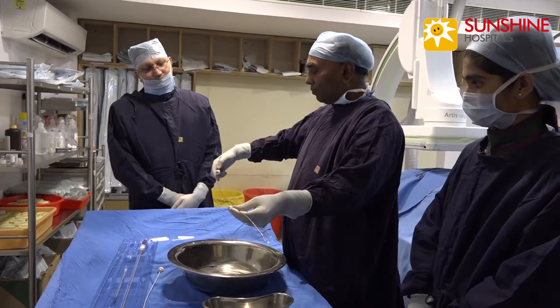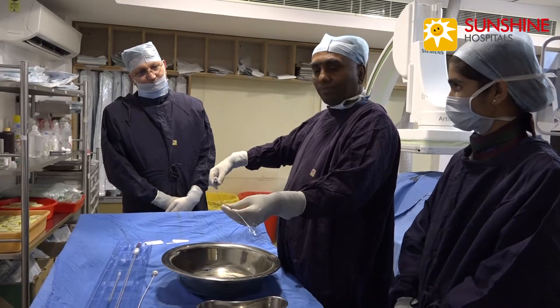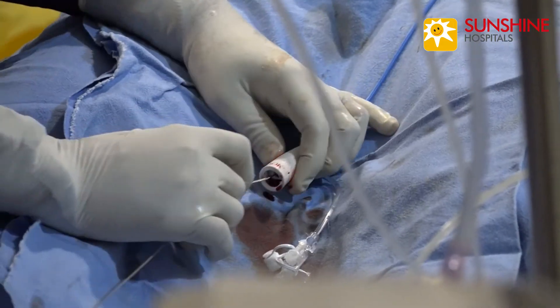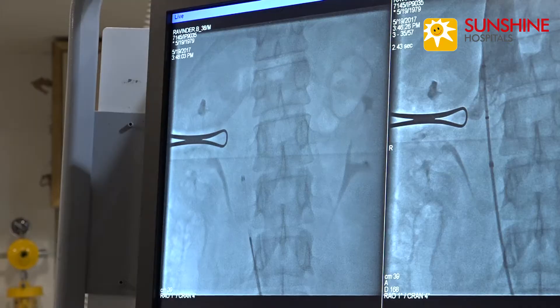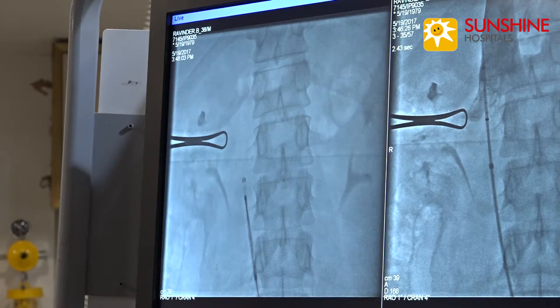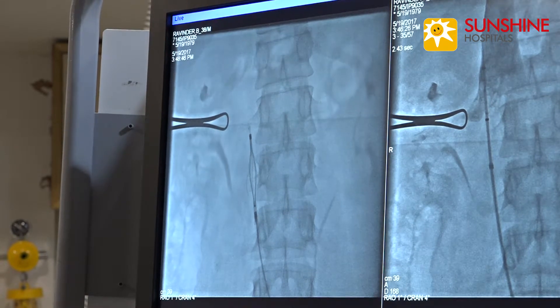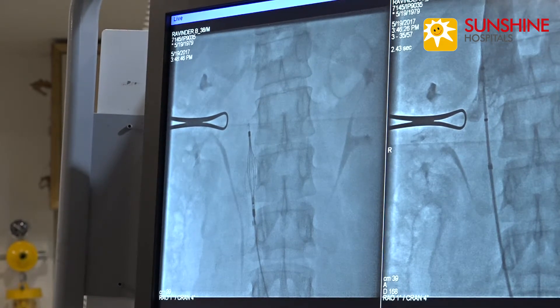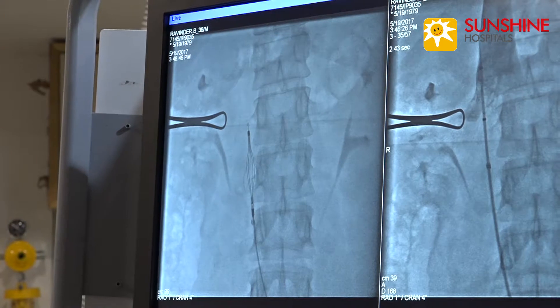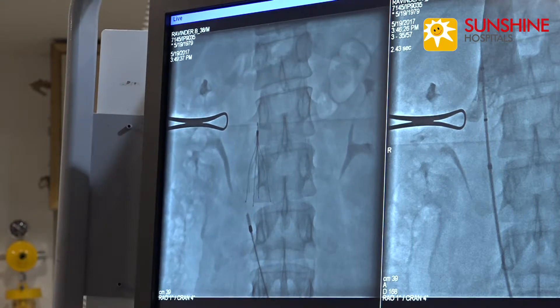It has got a deployment mechanism. This is for unlocking; this black one is for deployment. Now you are able to see the IVC filter at the tip of the sheath. Now the sheath is out. Now we are pressing the red button. Now we are pressing the blue button. The IVC filter is deployed infrareanally.